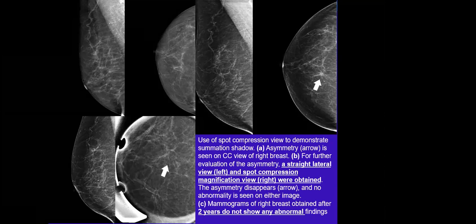It is not technique. It is the posterior part. You are right, you start correctly. It is in the posterior part. Excellent. If the lesion is posterior, close to the chest wall, seen in one view, one projection, you might expect that in the other view it is not included in the field of view of the receptors, that it is excluded and not seen in the other image.